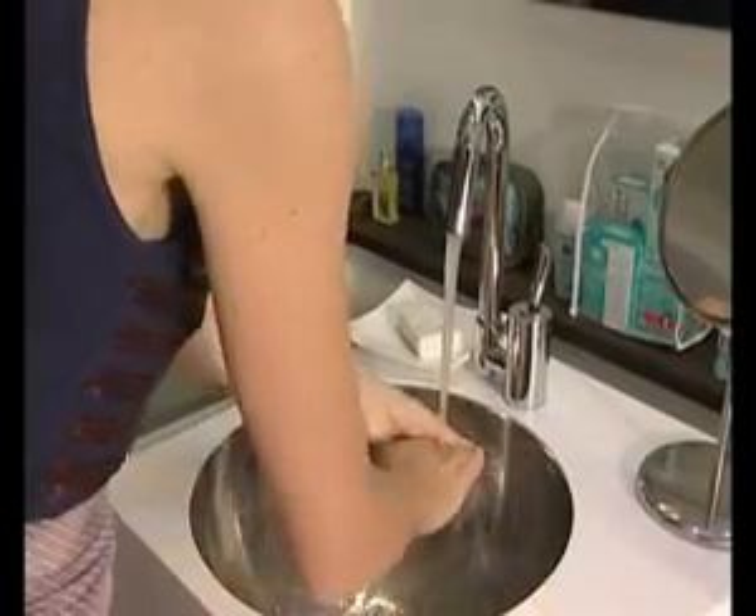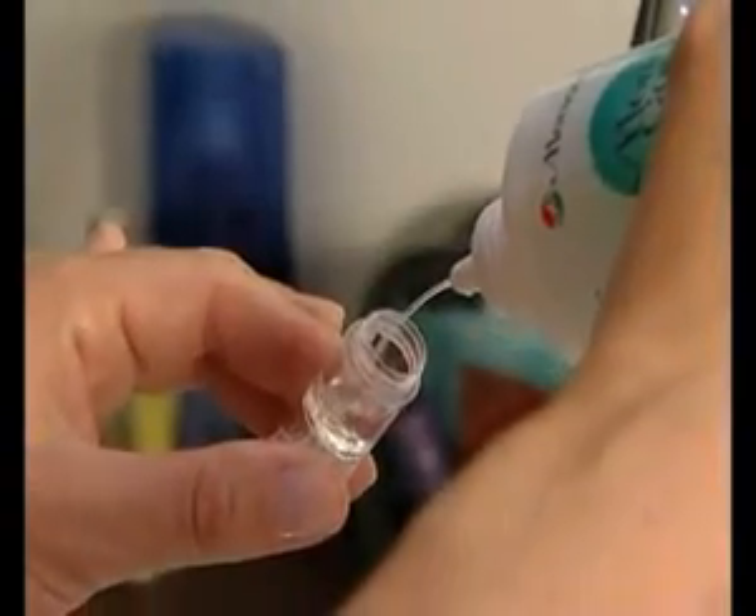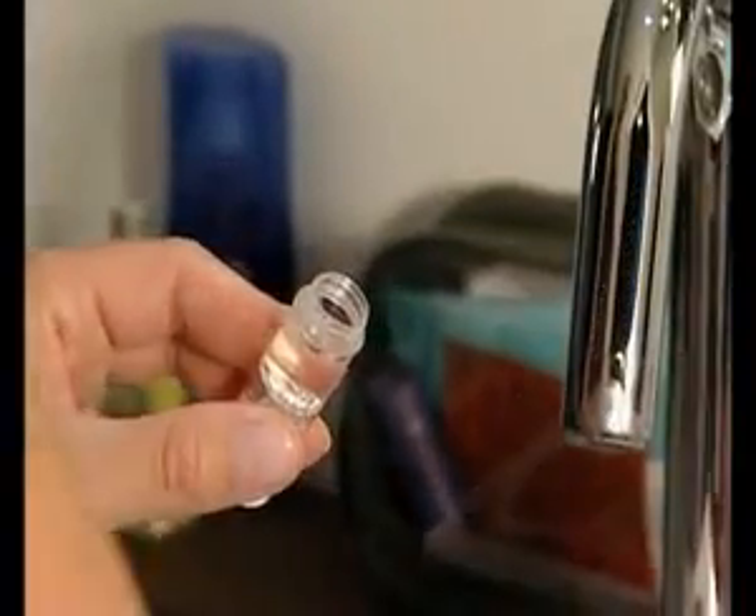Always remember to wash, rinse, and dry your hands before handling your lenses. Fill the lens case with Medicare Plus solution.